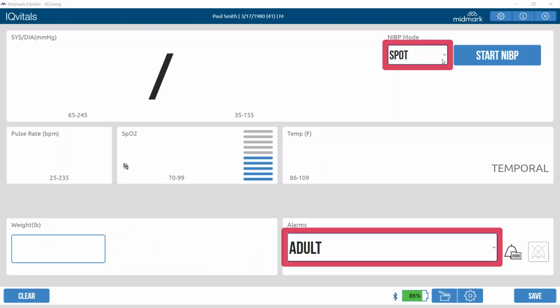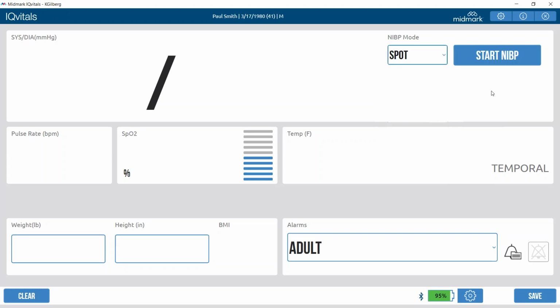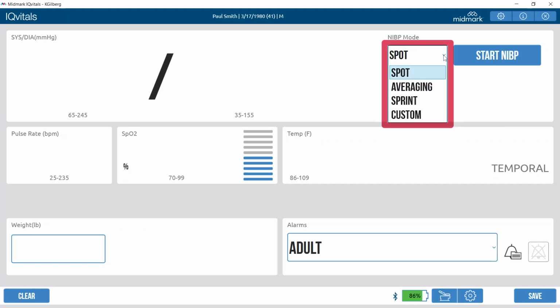The drop-down menus are indicated with a blue outline and an arrow icon on the right side. When any drop-down menu is active, all other buttons outside the drop-down menu are disabled. Click anywhere outside the drop-down menu, or make a selection to close the drop-down menu, and activate the entire main screen. The NIBP mode drop-down menu allows the user to make a selection: spot, averaging, sprint, or custom.